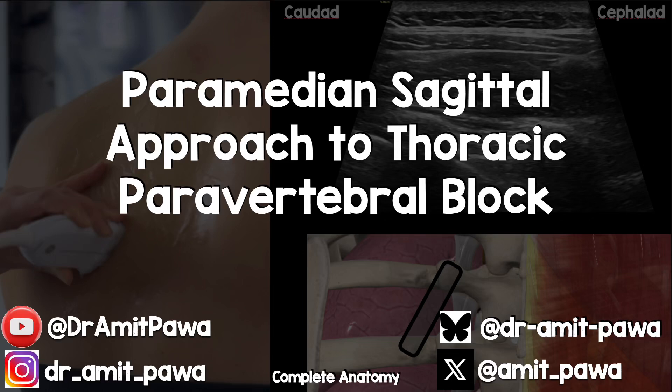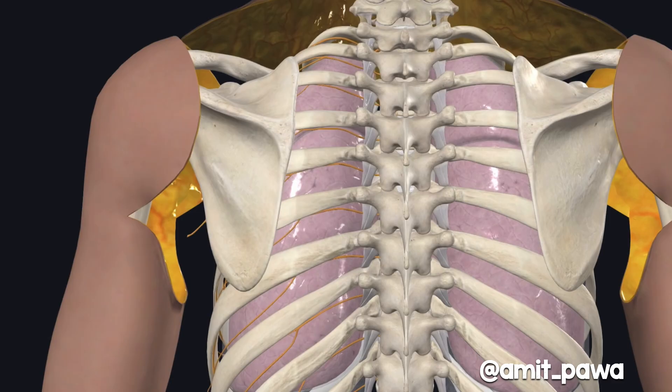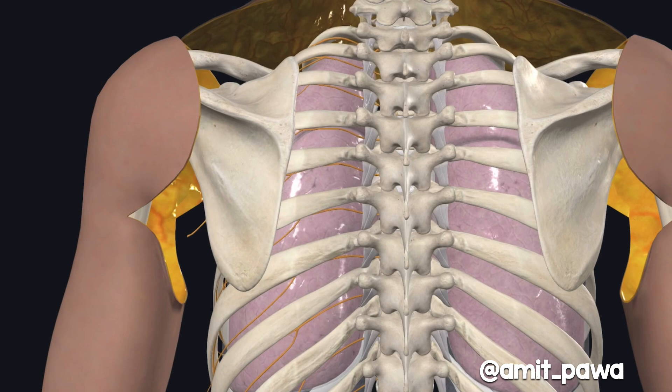Hello, my name is Amit Power and welcome to my updated video on the paramedian sagittal approach to the thoracic paravertebral block. We're going to start off with some anatomy here. You can see we've removed the skin, the soft tissue and the muscle, and we're now exposing the vertebral bodies with the associated spinous process, lamina and transverse process and their articulation with the ribs. We can also see the pleura, the superior costo-transverse ligament and the intercostal nerve in the paravertebral space.